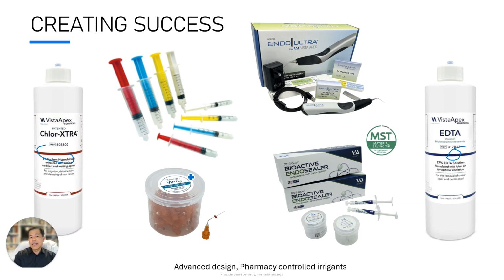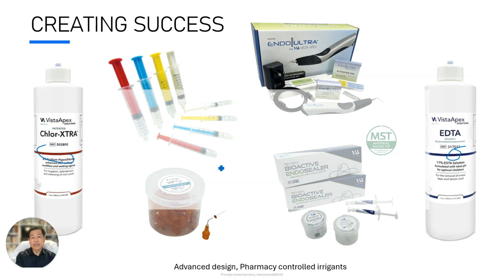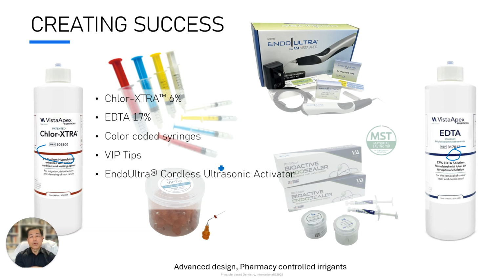So this, again, is the type of predictability we can get. If you go back and look at all the YouTube programs that we've done, we've given you tip after tip of how to use the different materials and how to gain this kind of confidence in your endodontic success and your restorative success. So I use a Chlorextra 6%, and then I use the EDTA 17%. Then we use the color-coded syringes that have the VIP tips attached to them, so we can use a dual side port to get the irrigants safely into the canals.